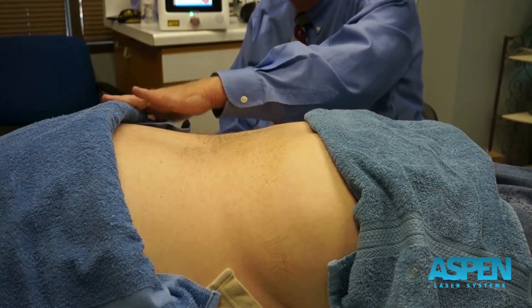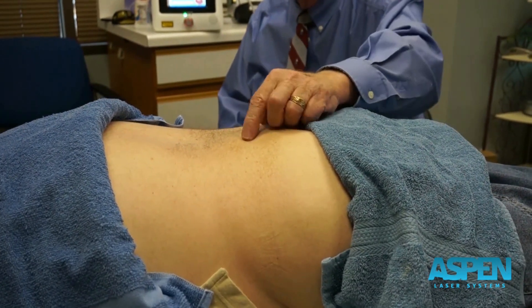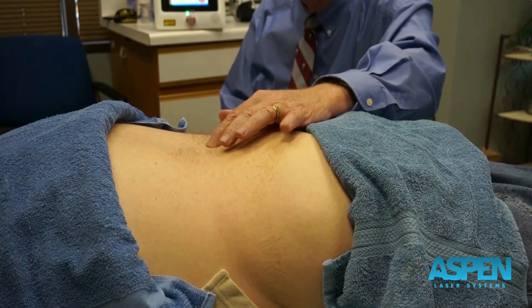I gown and drape my patients so that we keep the area exposed, and very often I will use a red magic marker to locate my area.